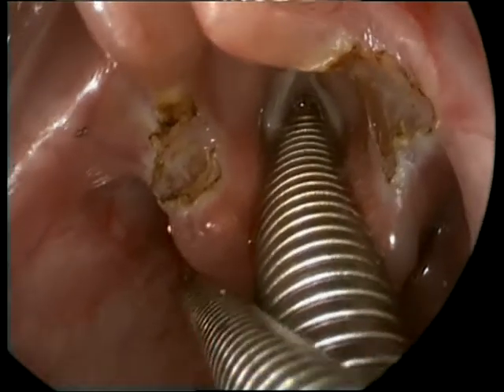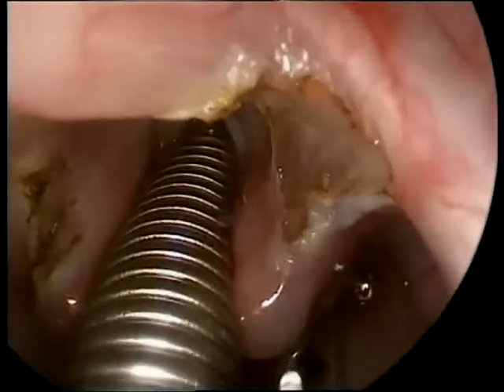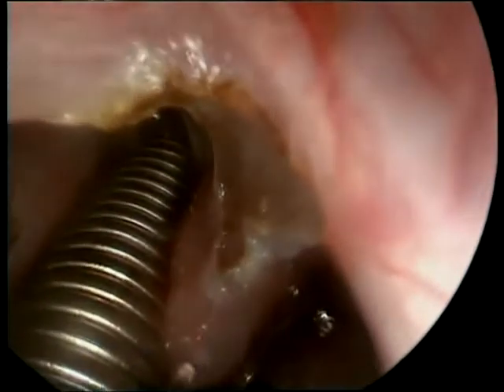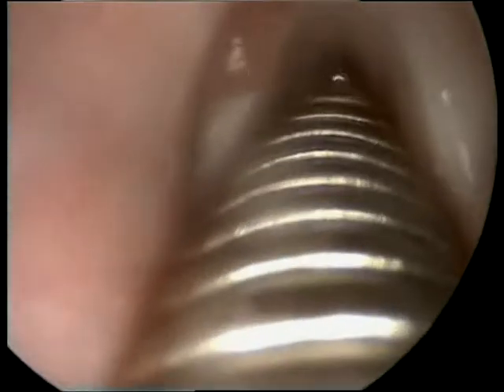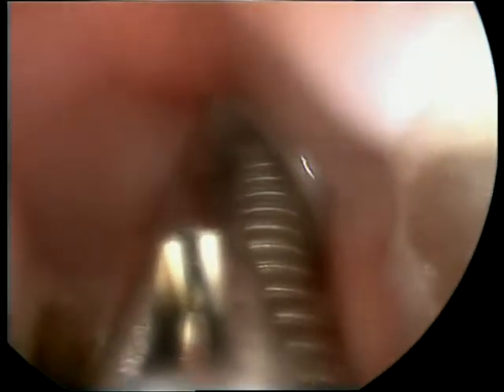The cuts seem to be adequate and symmetrical on both sides. Therefore, we move on to work on the mucosa covering the arytenoids. The aim for this part of the procedure is to cause thermal injury over the redundant mucosa over the arytenoids, so once it heals it will become more stable and not fall into the laryngeal inlet. The interarytenoid space needs to be spared during this procedure not to damage the muscles moving the arytenoids.